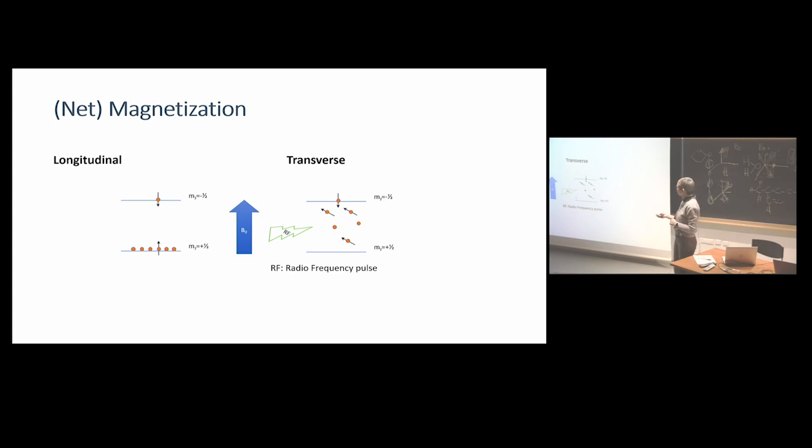But what we're looking at is always this in between. This means that there are spins that are jumping between energy levels. We don't know, and we actually do not care so much, well, most of the time. You will in the inversion recovery. So we don't care too much about which energy level it is in, besides the fact that they are changing energy.